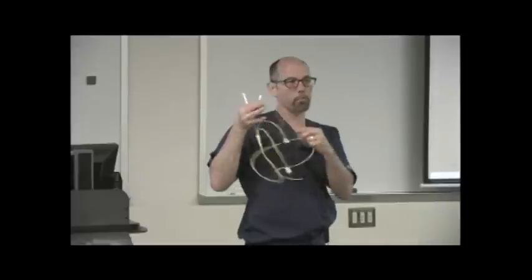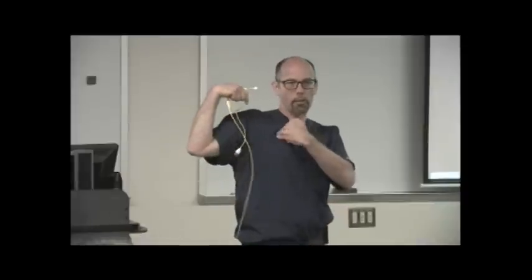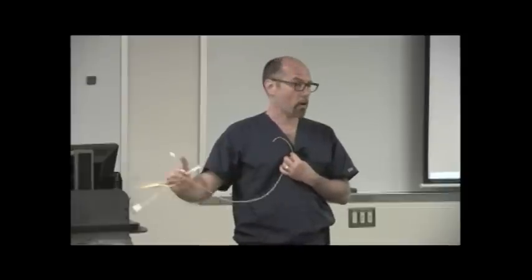The last thing that we can do with this catheter, and we do it, is we can inject a known volume of a solution at a known temperature at a precise rate and introduce that into the right atrium. So it's going to go through this blue line and time how long it takes that now subtly cooled blood, because I've introduced 10 mLs of room temperature IV solution as a bolus, how long it takes that bolus of IV solution to get from the right atrium to the distal tip in the pulmonary artery. And in doing so, I can calculate the patient's cardiac output off of that. It's called thermodilution cardiac output. It's the most standard, traditional way of directly measuring a patient's cardiac output. There are other ways. It is typically the most standard way of measuring cardiac output, thermodilution.